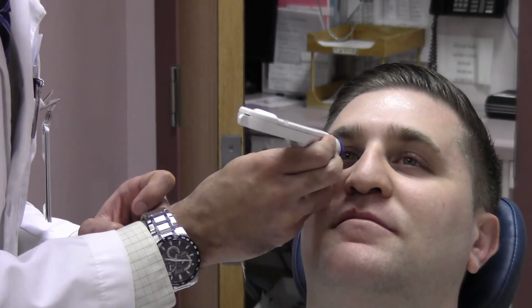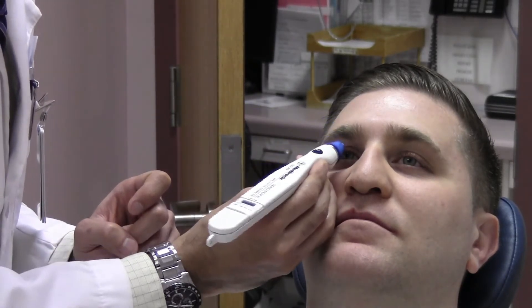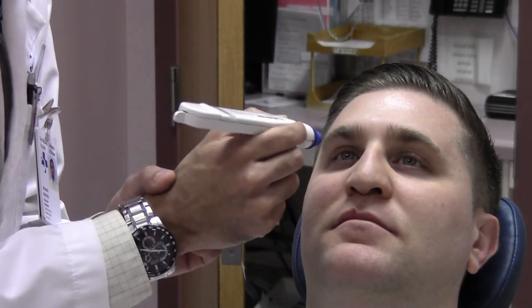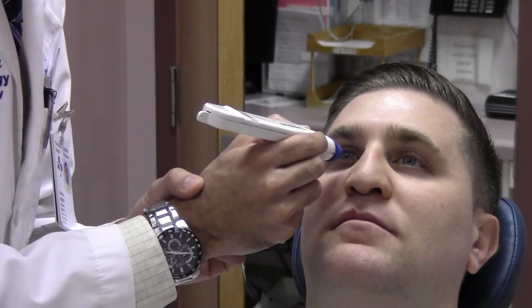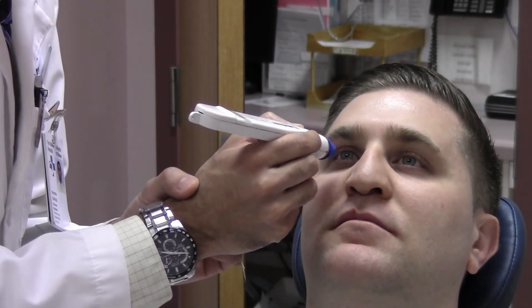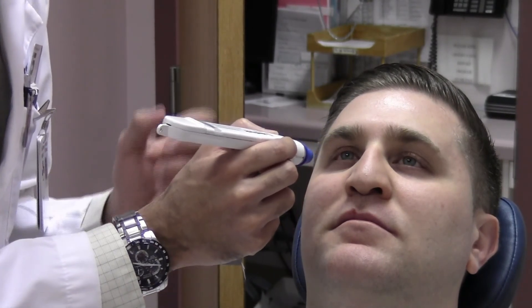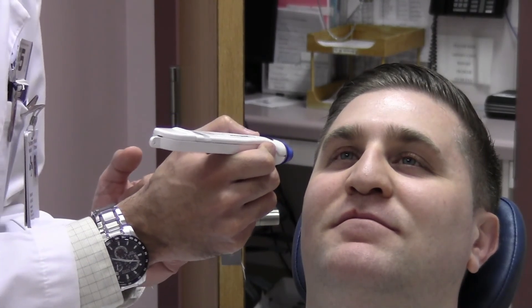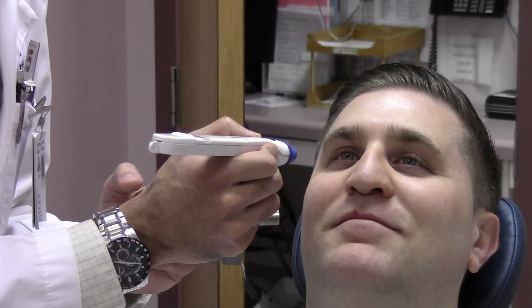It's important to keep the tonopen perpendicular — holding it at an angle would be incorrect. Also, holding it in thin air would be incorrect, as the pressure applied would be uncontrolled. It's also important to have the patient relaxed and not squeezing, because squeezing artificially raises the pressure. And that's all there is to it.